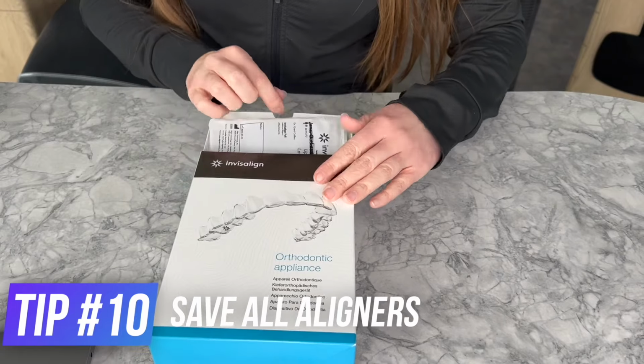I also recommend to my patients to save all their previous aligners. Not only do you now have a backup set where you can go to the previous set if you lose an aligner, but also if your teeth start getting off track or not tracking super well, we can back up to a certain aligner and just slow up the process a little bit to get you back on track without having to order a bunch of new aligners for you.